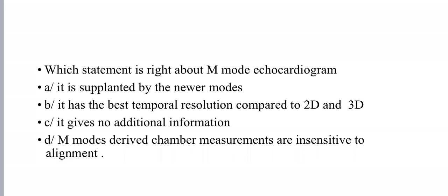So the correct answer, I agree with you, is B. And by the way, M mode has the best temporal resolution. Despite that, the newer modes, 2D and 3D, are more informative than the M mode, but still M mode has a place in the diagnosis, and sometimes it gives additional information beyond the information that could be provided by the 2D.